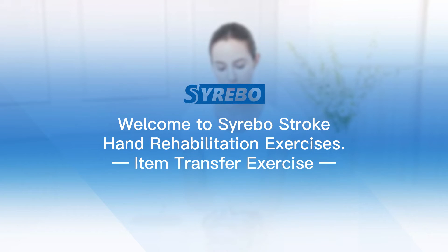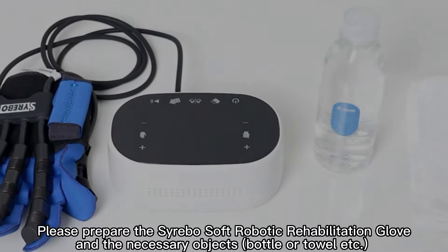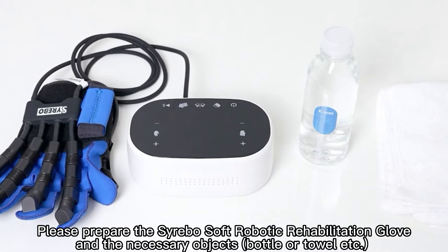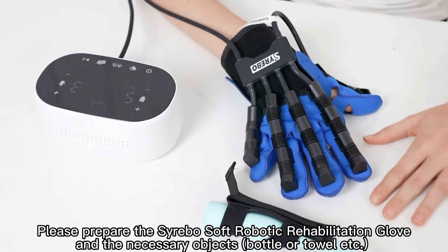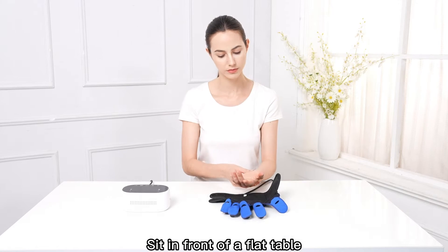Welcome to Syrebo Stroke Hand Rehabilitation Exercises. Item Transfer Exercise. Please prepare the Syrebo Soft Robotic Rehabilitation Glove and the necessary objects, such as a bottle or towel. Sit in front of a flat table.